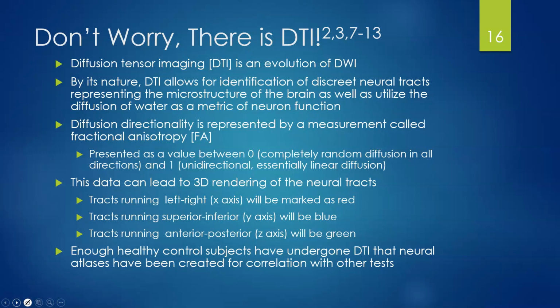We've done enough studies with DTI and functional MRI and done dissections that we can create very detailed maps or atlases of the brain, and we can then better connect the imaging findings to other test findings, like neuropsychological testing, which is pretty cool and very promising for our ongoing management and treatment of our concussion patients.